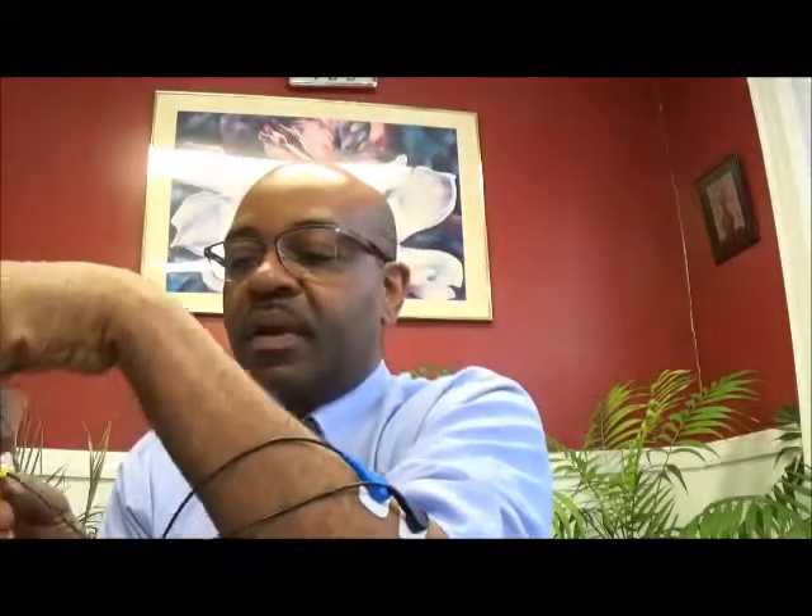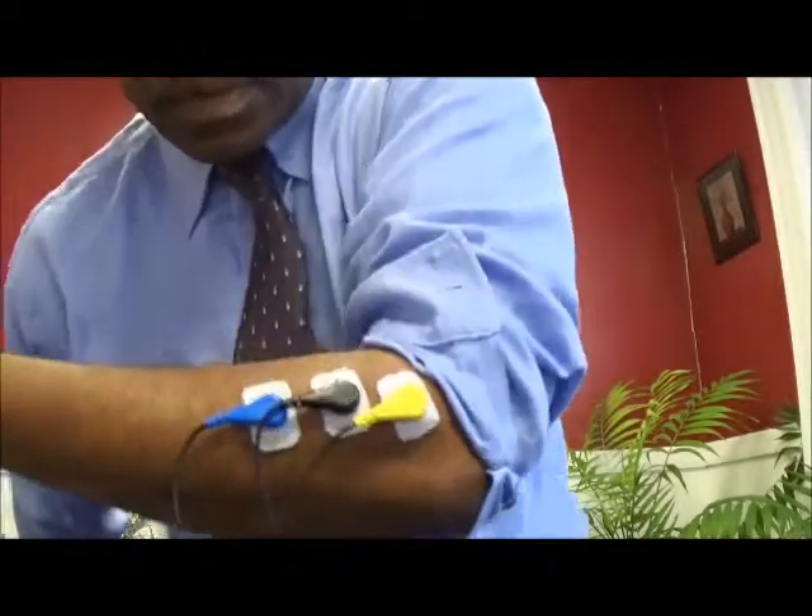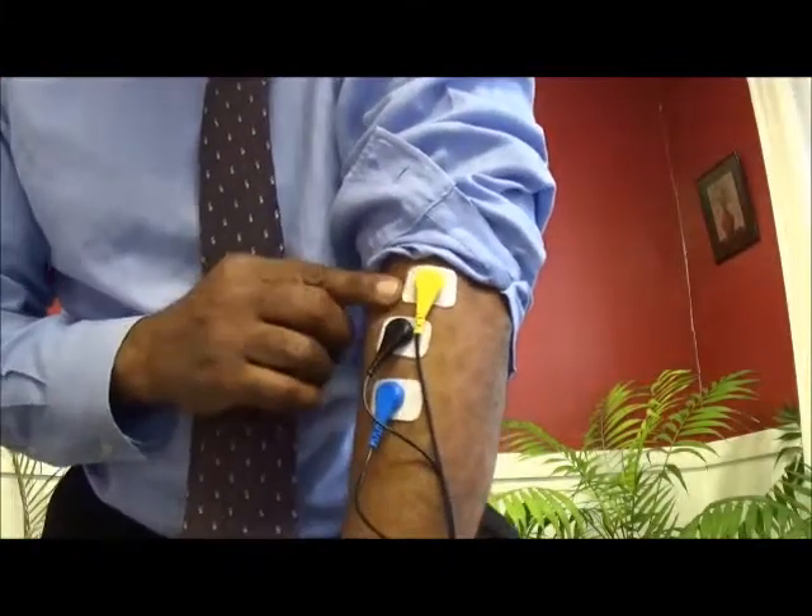Now we place the electrodes. We peel one off the plastic backing and stick it on the skin in the area we want to record from, usually finding where the muscle is — have the person flex and feel the muscle. We place one — this is the active, which is blue in this case on the Thought Technology equipment. Then we peel the next one and place it above that. Then we peel the last one — the black one is the ground — and place the yellow one as well. Now we've got those all on the arm.